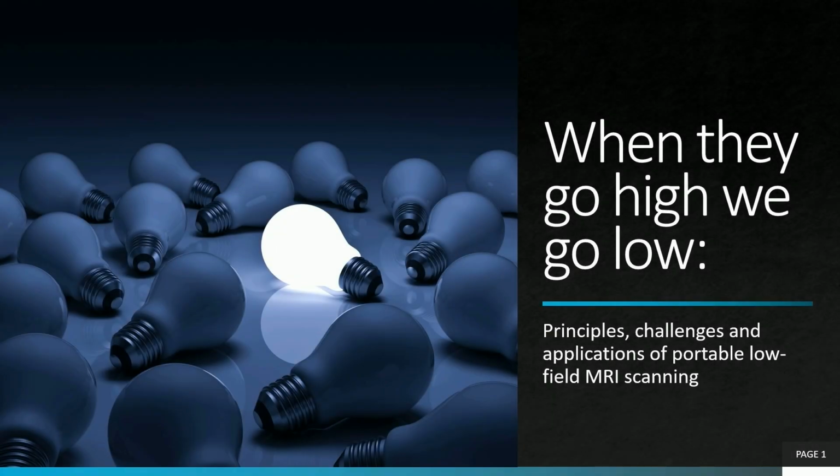Start. Probably a few more people will join later, but I will make a head start with our educational session on ultra-low field MRI. I really want to welcome you all because I think it's also one of the first educational OHBM sessions on this neuroimaging modality. So today we'll really talk about ultra-low field MRI, and more specifically we'll give presentations where we use the Hyperfine Swoop scanner, which is 64 millitesla.